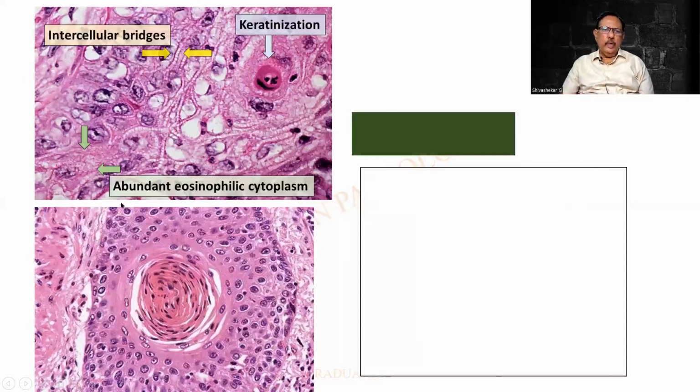So this is again a tumor. There are large cells and these are intercellular bridges. Look at this over here. So this is a nucleus. Some are pale, some are dark, and in some regions they tend to form a more eosinophilic material. It looks like keratin. So this is a better one.